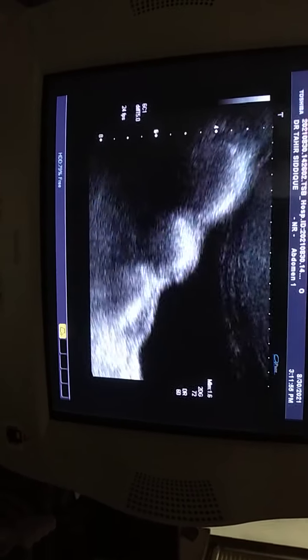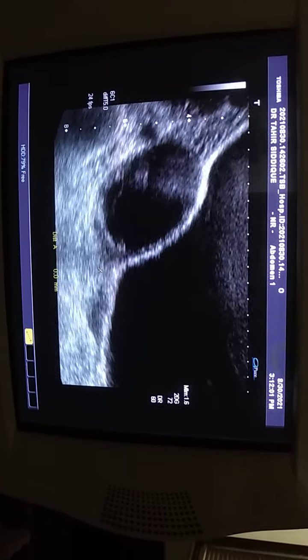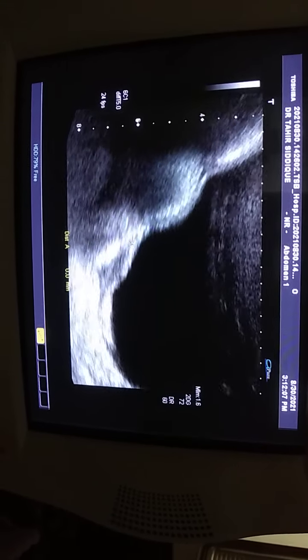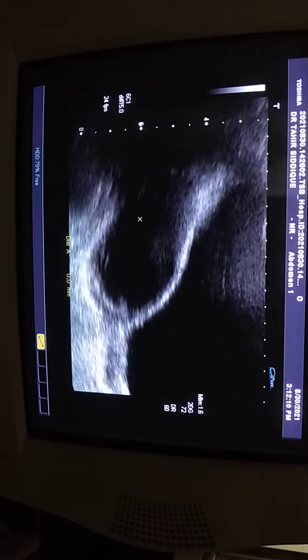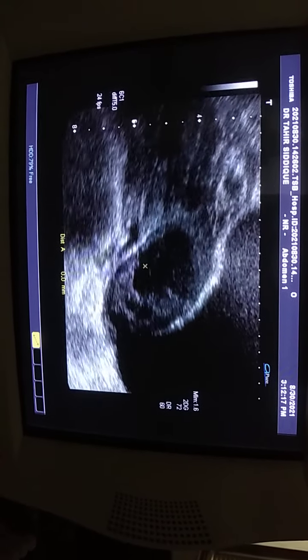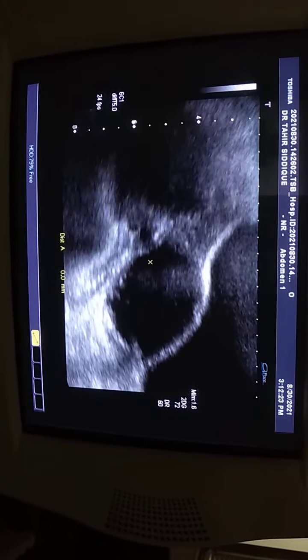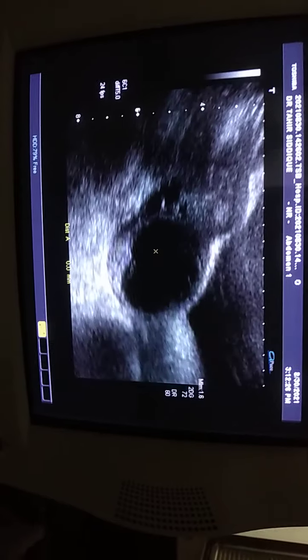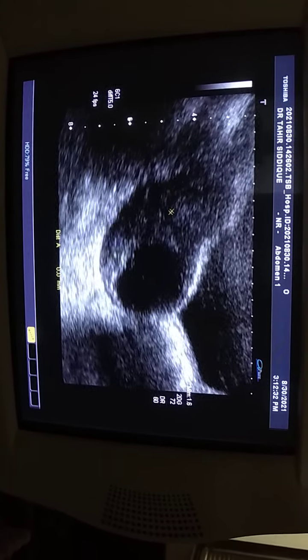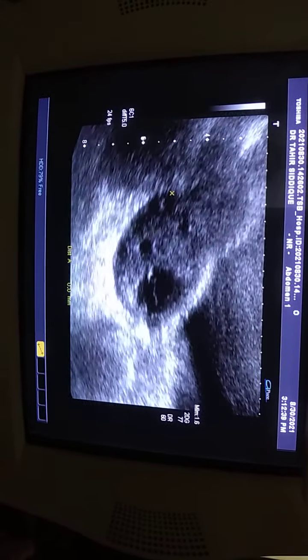Here. Now this is the right side, this one, cervix, and the vagina, and it communicates with the cystic area, fluid filled with echoes, islands of echoes interspersed throughout, and then it communicates with the rest of the right-sided uterus. This is the right-sided uterus. Now this is the ovary. You see the follicular development, 1, 2, 3, 4, 5. This is the right ovary.